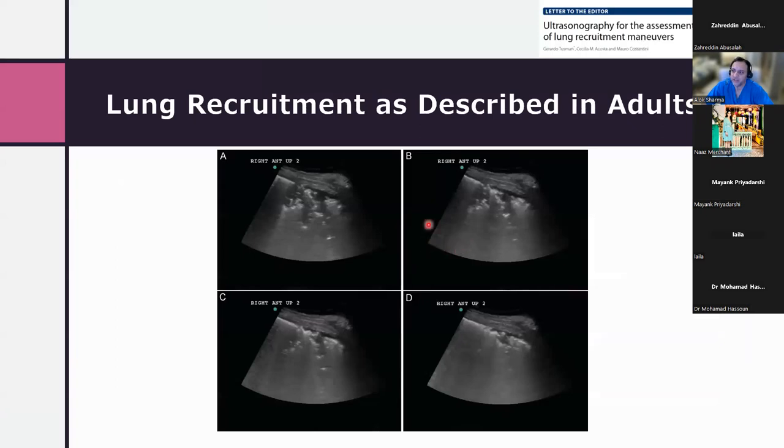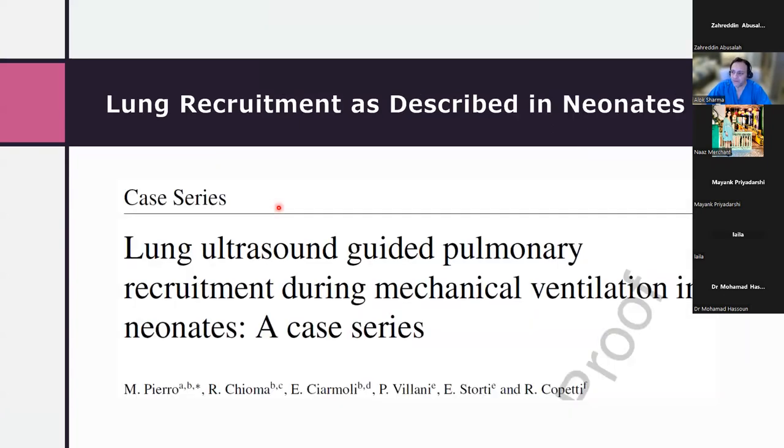And that's what I would say to you, that this could be a collapse consolidation. These are deeper consolidations and there might be an area of lung that's not going to recruit. And that's why you need an endpoint. You really need to see whether, a good example is non-invasive ventilation.